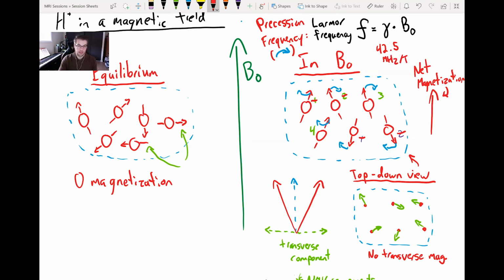And that is important because that means that our frequency is going to be in megahertz generally, and it varies depending on the field strength, right, per Tesla. That's why it's multiplied by, oh, thanks for looking that up. 42.58. So I was almost there. Sweet. So yeah, it's in megahertz that these hydrogen atoms are going to be rotating.